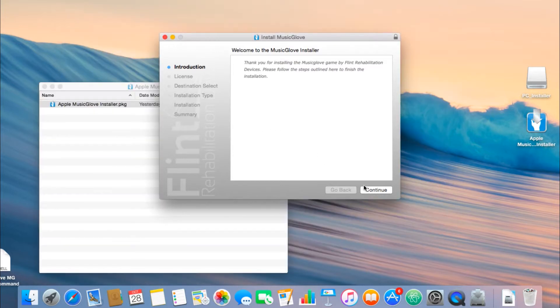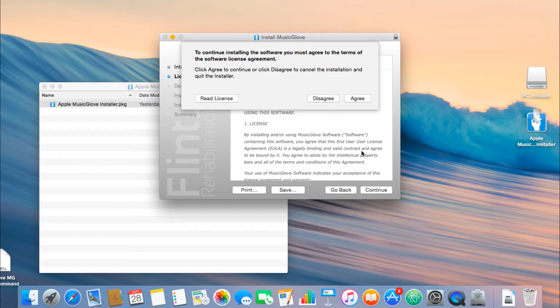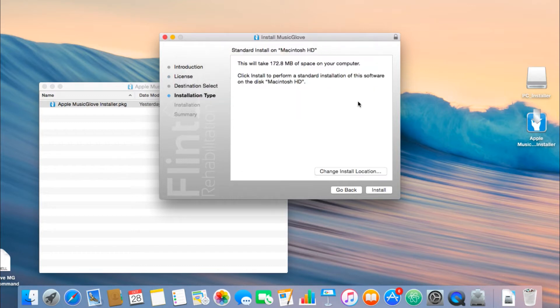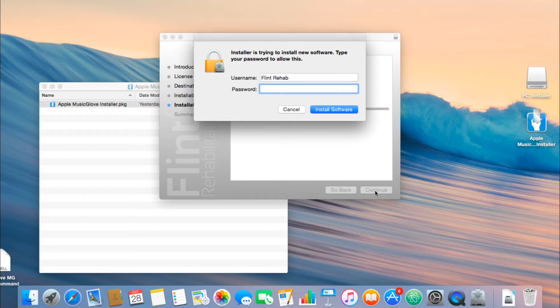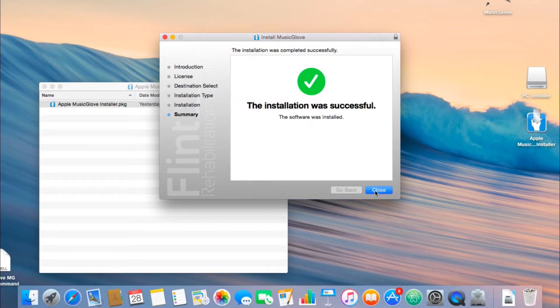Click Continue in the installer program. After reading the software end-user's agreement, click Continue and agree. Next, click Install. Then type in the password and click Install Software. The installation process should take 1 to 3 minutes to complete. After installation is complete, click on Close.